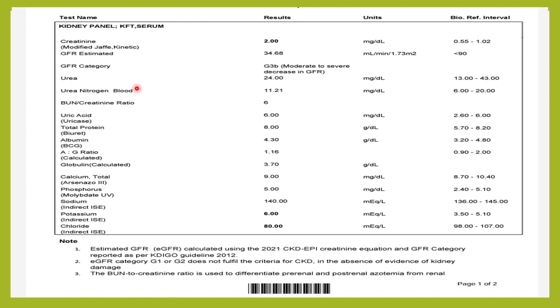I'm Dr. Divya and let us today start with the kidney function test or the renal function test. This is the test which is very commonly done in any of the laboratories and gives us lots of valuable information regarding the functioning of the kidneys. In the kidney panel, the KFT serum or the RFT, renal function test, KFT, RFT, all these are same.